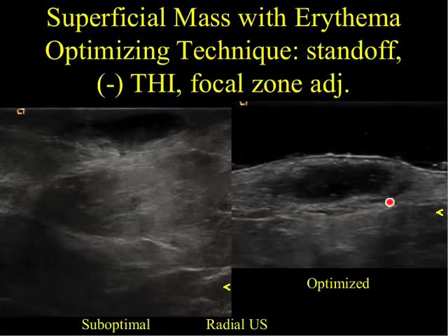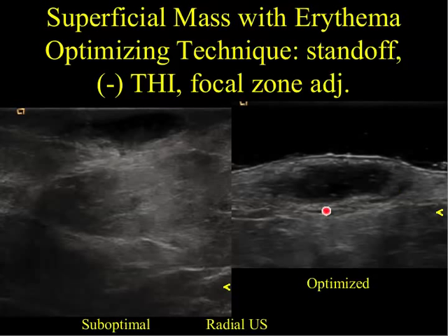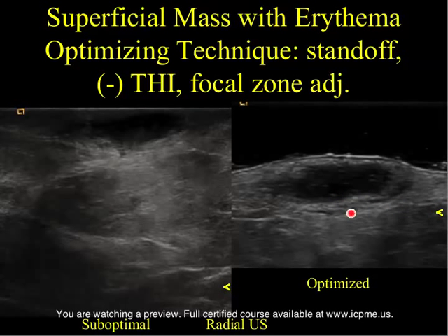We're going to take off tissue harmonic imaging. One of the things I find with harmonics is that you sometimes lose fine boundary detail. On the suboptimal image on the left, it's very difficult to visualize the skin line, whereas on the optimized image on the right, we can now see the skin line and we can see that this hypoechoic lesion is confined to the skin. So just by putting a standoff on, taking harmonics off, and adjusting our focal zone, we've created a diagnostic image.